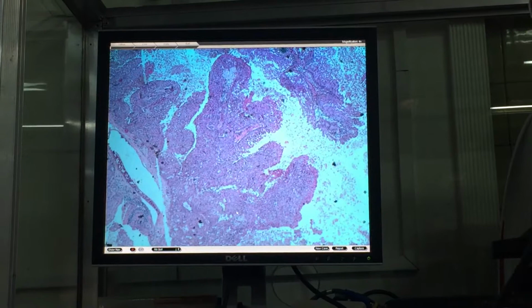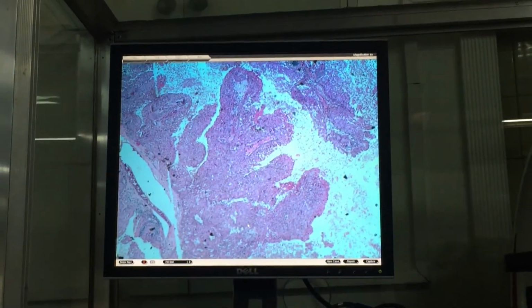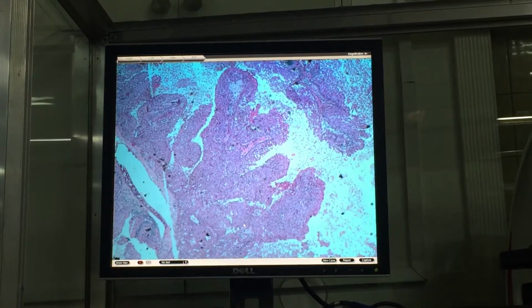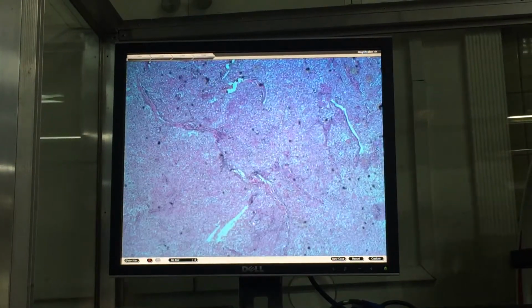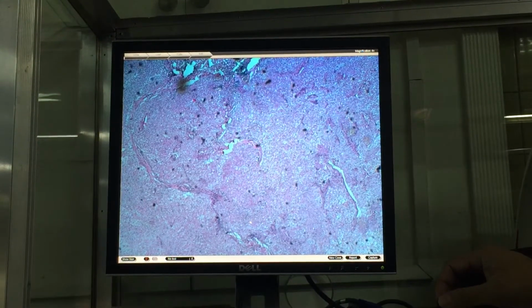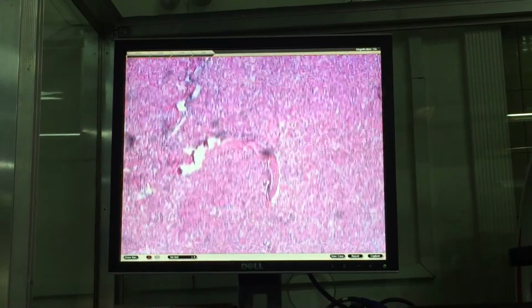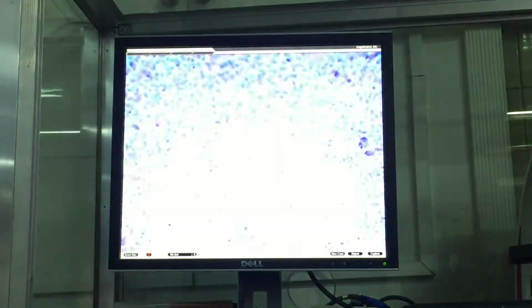They adhere to one another and they form one solid tumor. So remember this transitional urothelial carcinoma here. In some areas, they already form a solid tumor. So there are areas that are really high grade in nature.